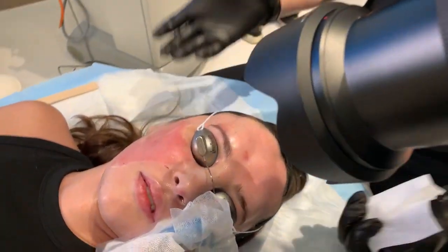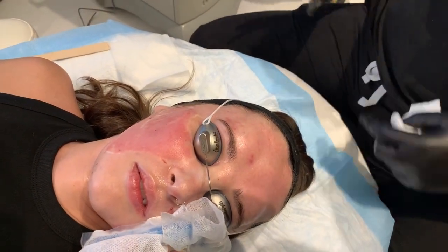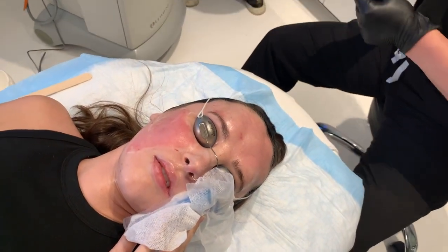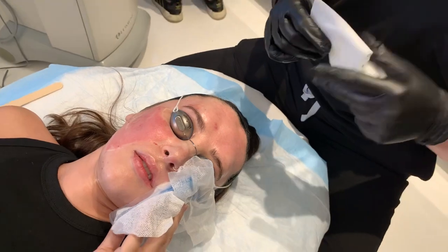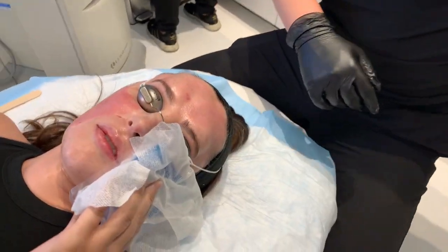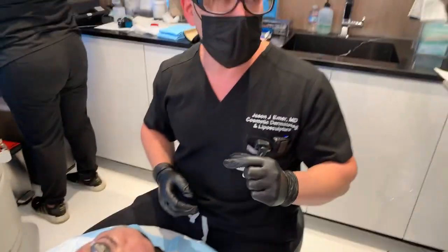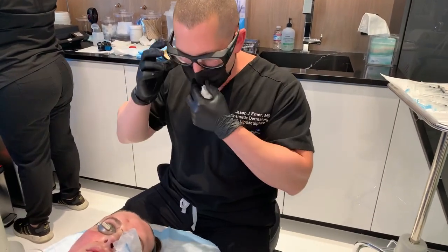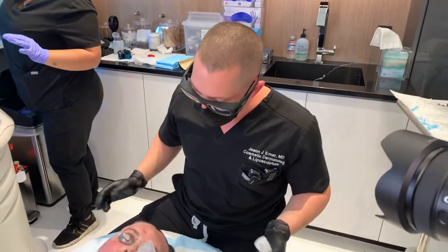And now what we're going to do is we're going to come to the surface. We're going to really remodel. And she's done, again, she did a really strong treatment in the past. Does it burn for her afterwards? So yes, this is going to feel like a sunburn. It's also why we do all this numbing, because the numbing really helps kind of calm the skin down for the next few hours. And the next few hours is when the swelling comes, when the redness comes. So we want her to not feel that. So we're going to do that.